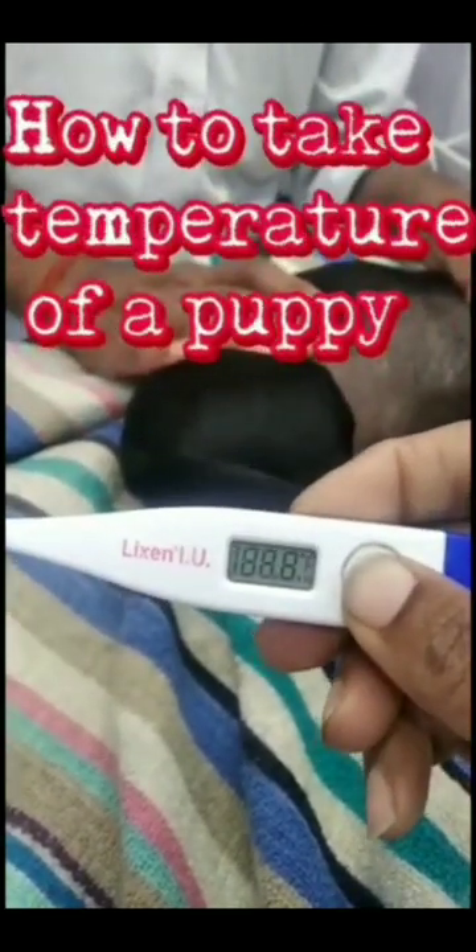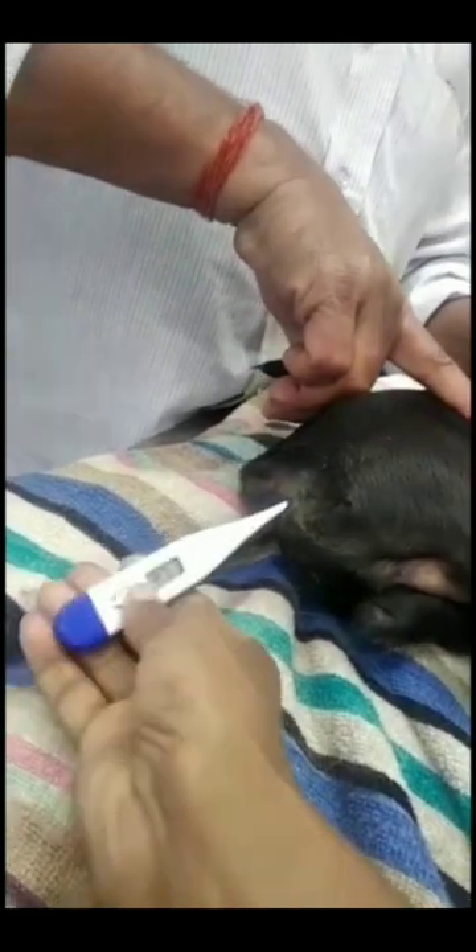How to take the temperature of a puppy: take a digital thermometer. When you switch it on, it will show the last two readings, then it will show 'low.' Insert it into the rectum in a rotational manner and tilt it to one side so that the bulb touches the rectal wall. When the thermometer gives a beep sound, take it out and read the result.